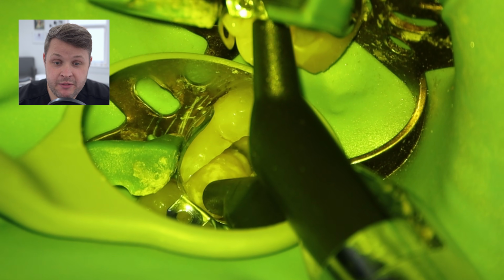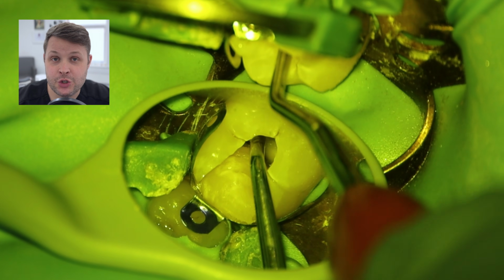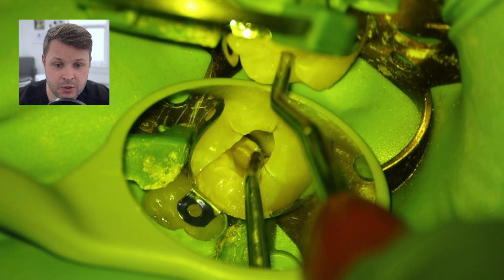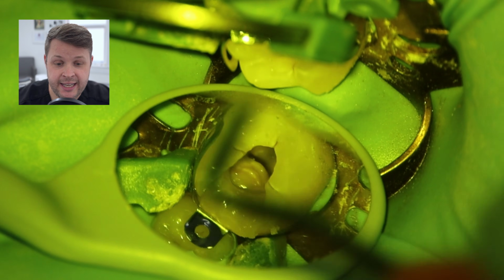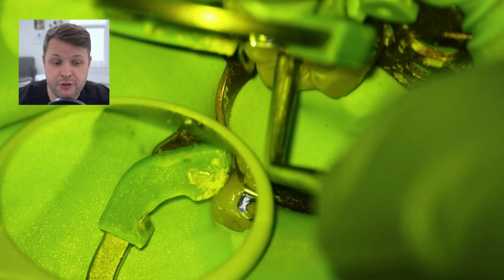And then once we've set the flowable in the base of the cavity, we're just going to use some normal bulk flow composite just to build up that wall. And I suppose it goes without saying, or maybe it's not obvious to some people, but it's really, really important to make sure that you put a good solid foundation into a tooth prior to commencing root canal treatment, and obviously there's a few reasons for that.